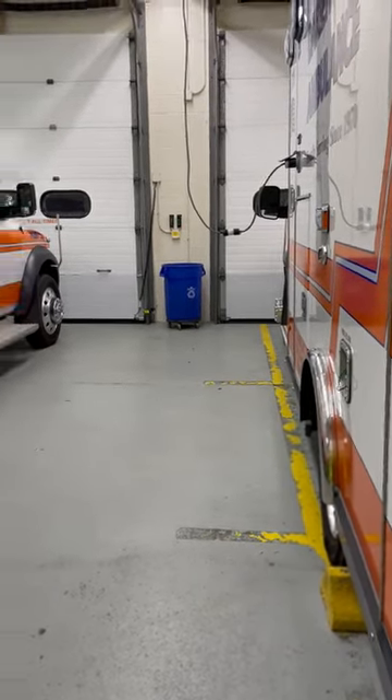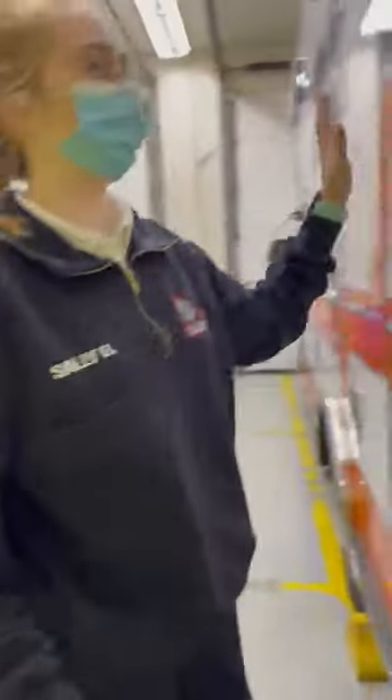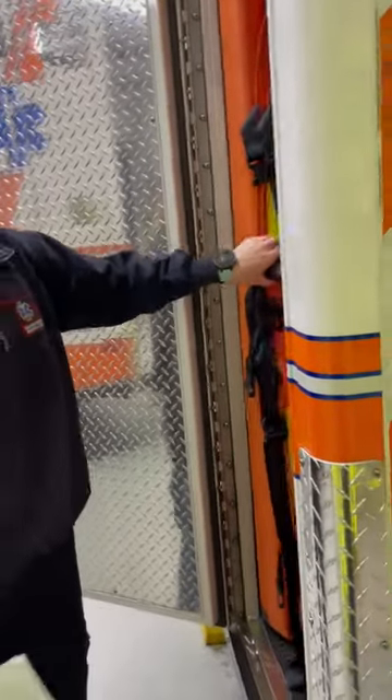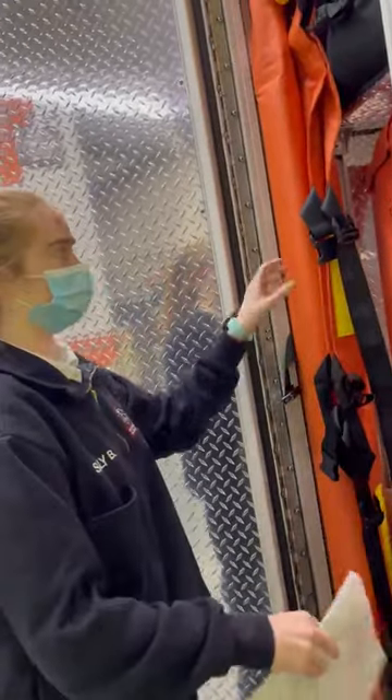Roger training episode six: the Reeve stretcher. Found in the driver's side rear outside compartment. Right here — don't get it confused with the long back boards or the splinting boards.